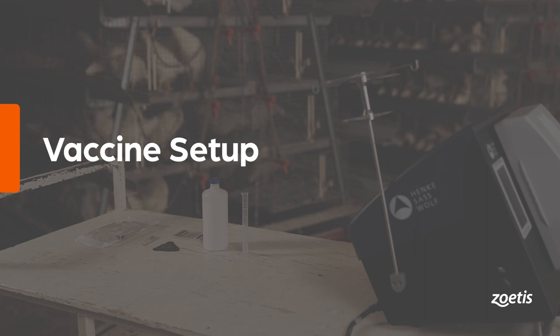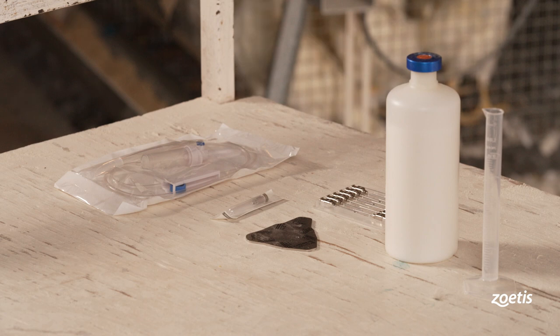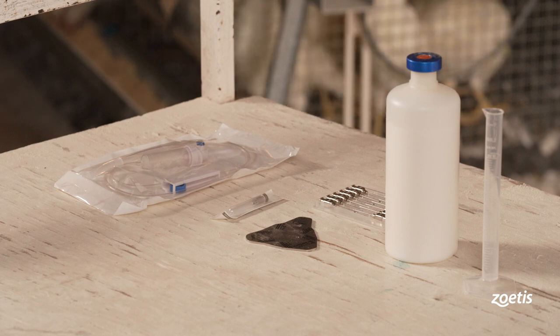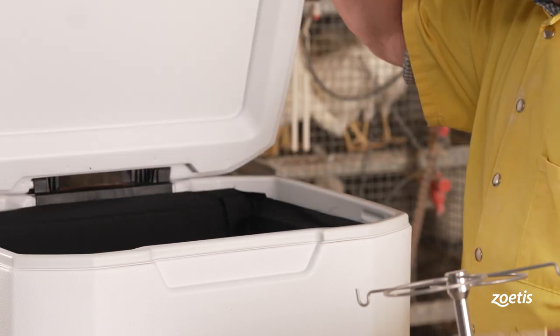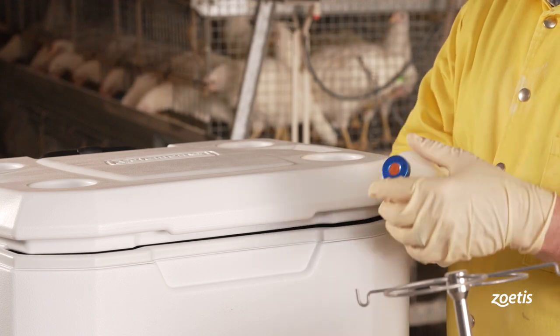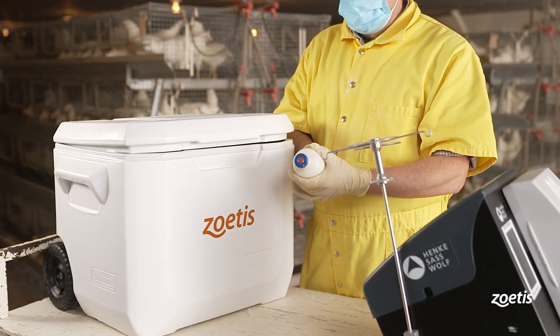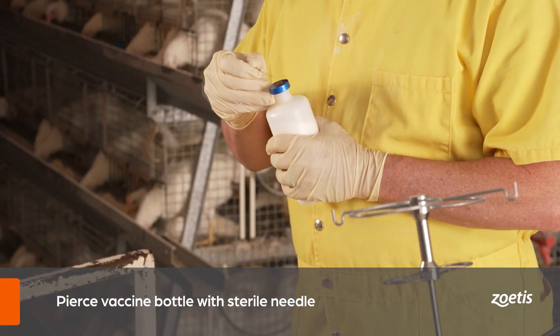Part one: vaccine setup. In this section we will go over proper vaccine setup for the double breast vaccinator. Prior to setup, ensure that the condition and temperature of the vaccine is adequate and adheres to recommendations by the manufacturer. Do not use vaccines that appear to be damaged or contaminated.